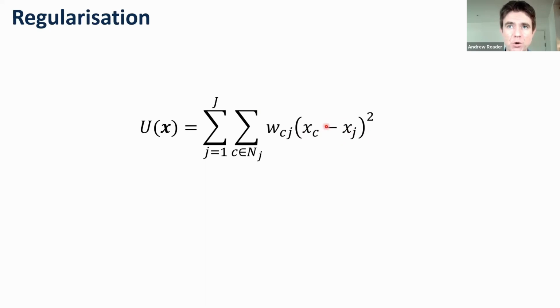And so we can see if the whole image were uniform, this would give us 0 energy, and so we're actually favoring those kinds of images. But obviously that's why, as Jakob was saying earlier, we need to trade off between our regularization prior and our data fidelity. We want to fulfill the data requirements and yet also fulfill the requirements of our prior knowledge that we're assuming about the image. That's why there's often a regularization hyperparameter like beta, or alpha squared, I think it was, that Jakob was using.